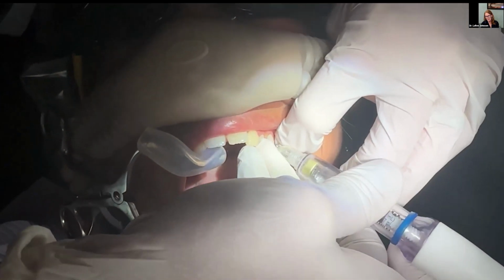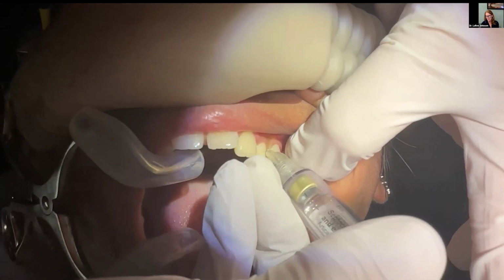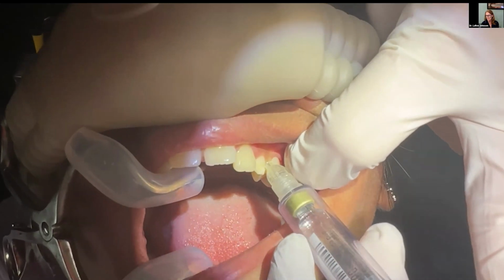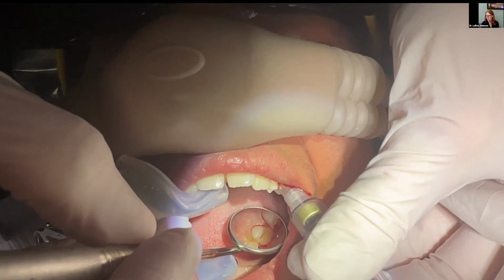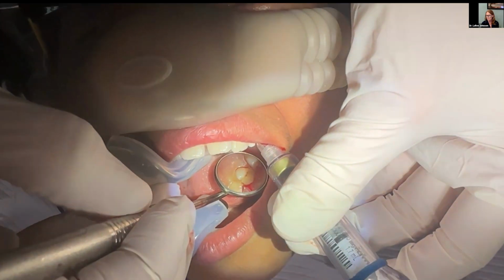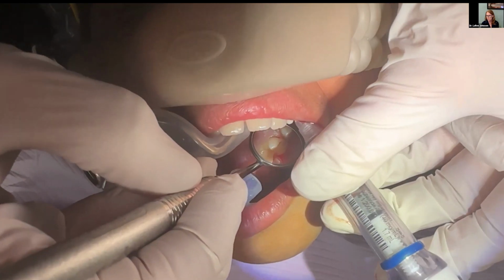And then I'm coming out. I just decided I was going to go for it. I think she was highly anxious. I feel like I over anesthetize for those children. You saw me do the spin to pop through it a little bit more. One thing I've learned is that now I'm looking and I'm like, okay, am I seeing that blanching? I hope everyone can appreciate in the mirror the blanching on the palatal side. That tells me that diffusion is glorious.